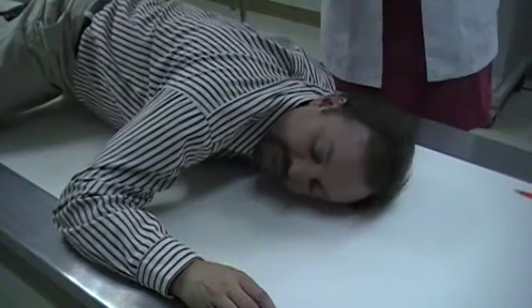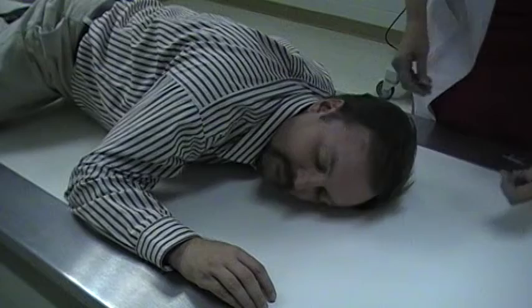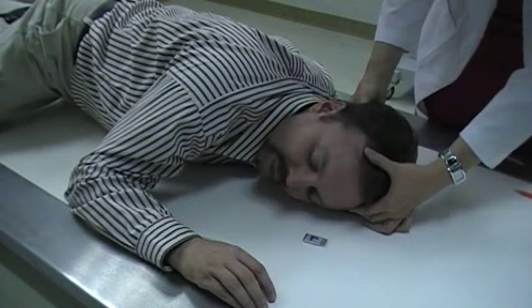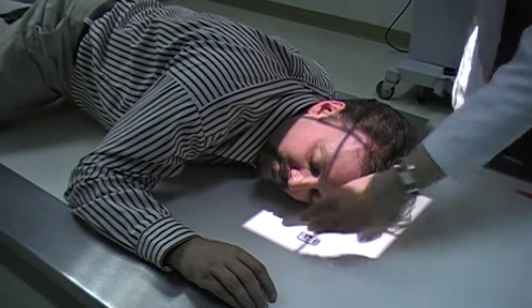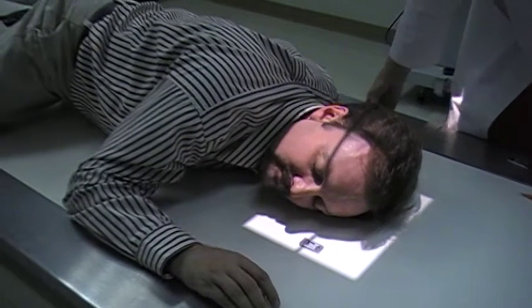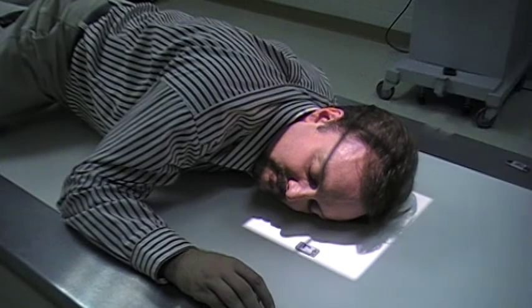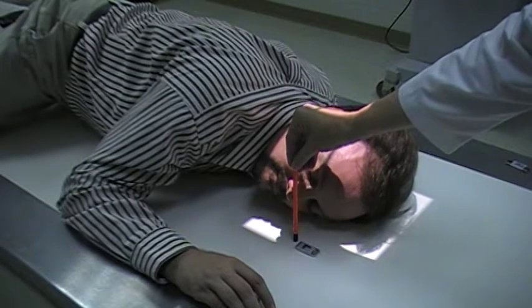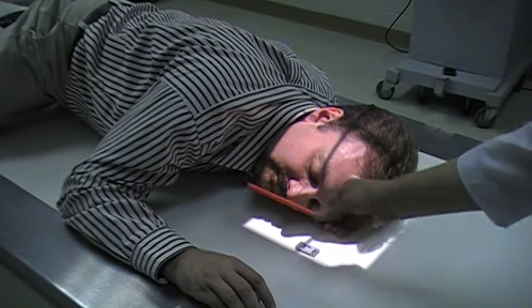So David is reversing his arms, left arm down by the side. Head is turned so that the left side of the face is down. And I've put my left marker out in front here. Central ray is going to be 2 inches above that EAM. Okay, we want to come around and check that the interpupillary line is going perpendicular. Our mid-sagittal line is going horizontal.